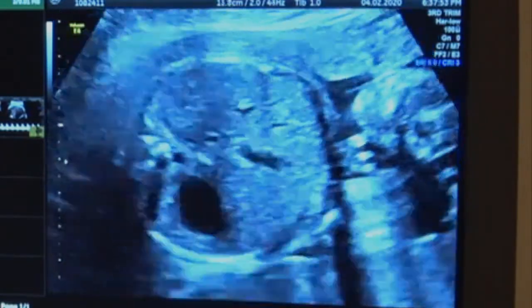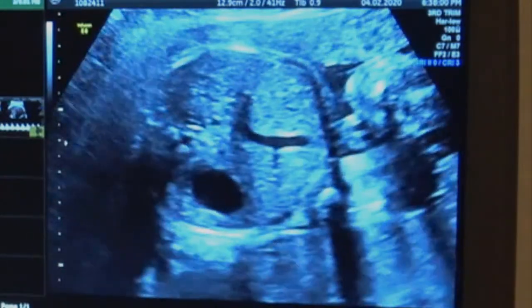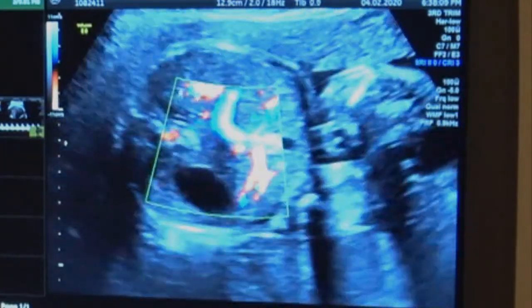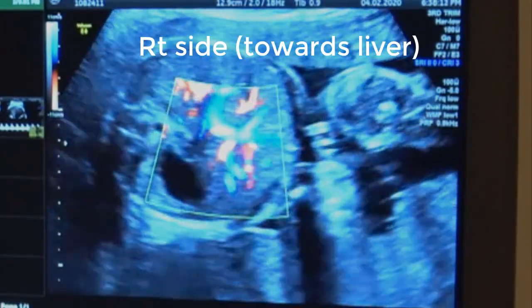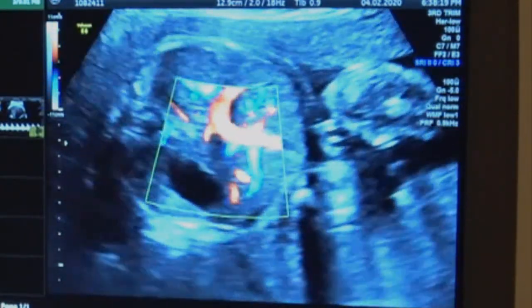So basically, if I was to do one here, I'd get your abdominal circumference plane, and the ductus venosus is a tiny little vessel that comes off that. It just comes straight off, but it aliases. That's the key to picking it up. It's just this tiny little one through here, and if you can't pick it up and you're struggling with it, you can always drop your PRF.